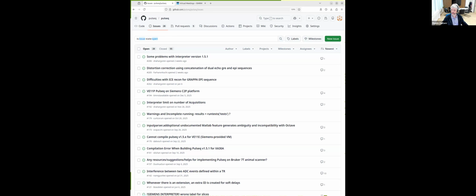From that moment on, the scanner is usable again and works without any issues. If you start at this point to restart something or fix the problem manually, in my experience it actually gets worse and you end up having to restart the whole scanner completely. So the best strategy, if you see this table undocked problem, is to do exactly nothing for a minute or so until the scanner control process restarts.